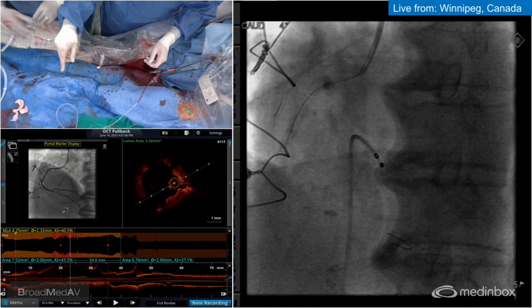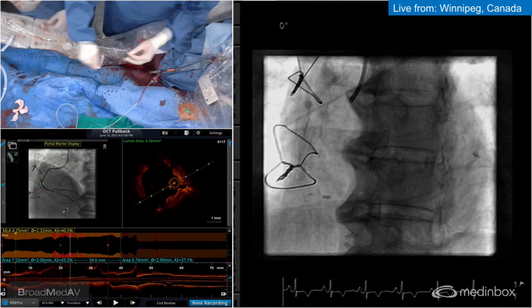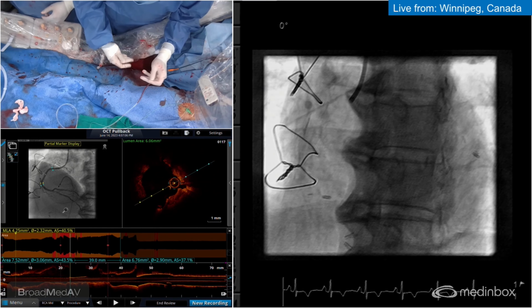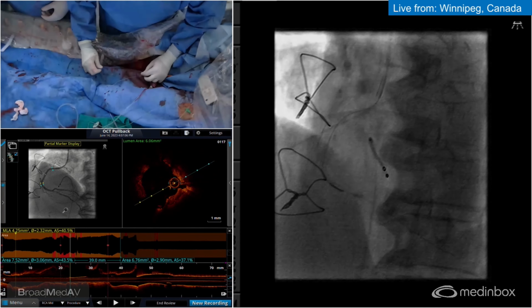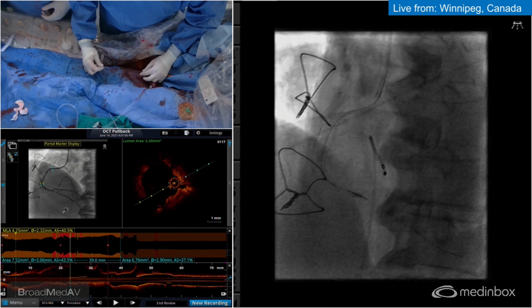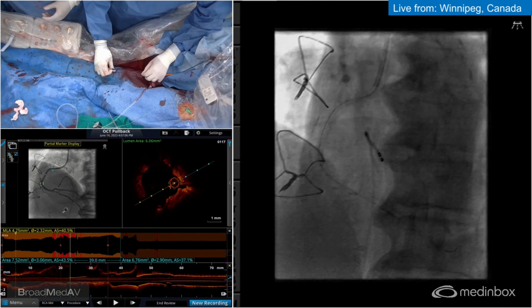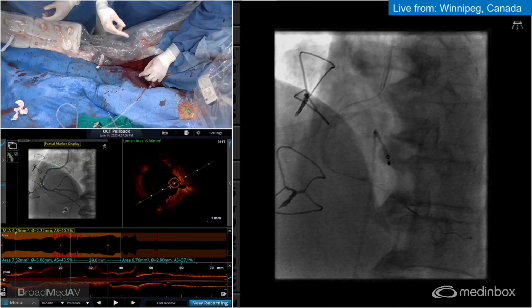You need to go up because I touched the corner of it. I'm thinking if you get the microcatheter pushing with this, another wire down, trapping wire in and the guide next to the wire. We'll go to the second marker and then we'll just inflate it there. Then our next step would be to open this anyway, so might as well try and get it done with the one microcatheter. So I'll just take this down as much as possible, going because once this is in, good.